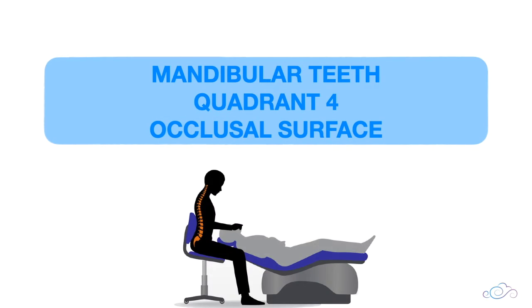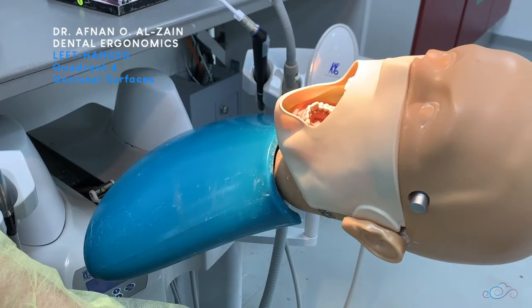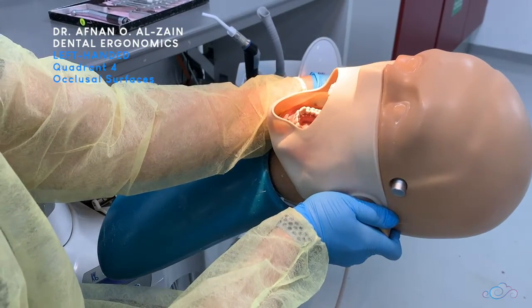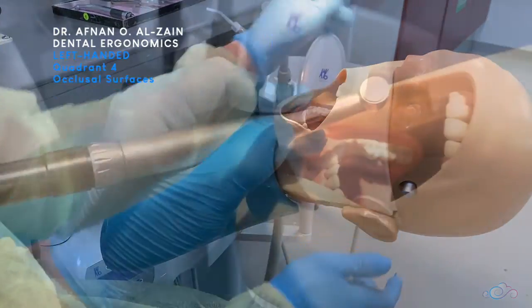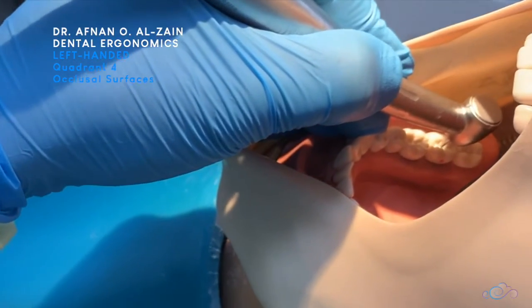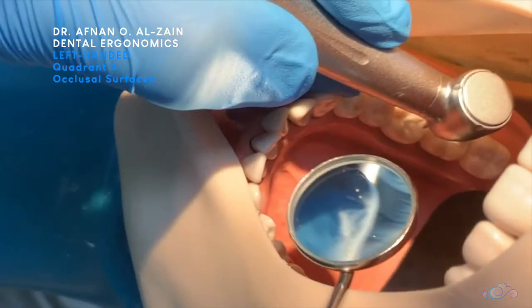Moving on to the occlusal surfaces of quadrant four. When working on quadrant four, you can tilt the dummy head position a little bit to the left so you can see the occlusal surfaces clearly. After that you're going to place finger support on the alveolar bone or teeth, then place the burr perpendicular to the surface, and use the mirror either to reflect the light or retract the soft tissue.